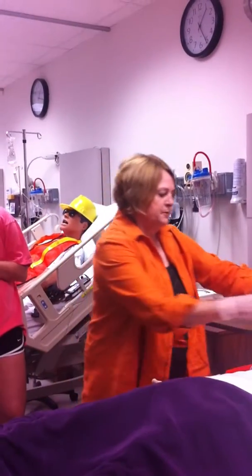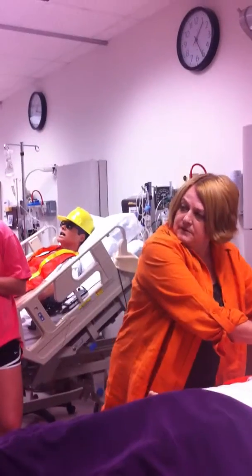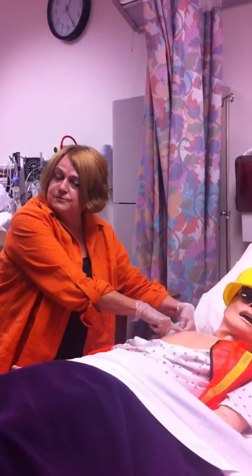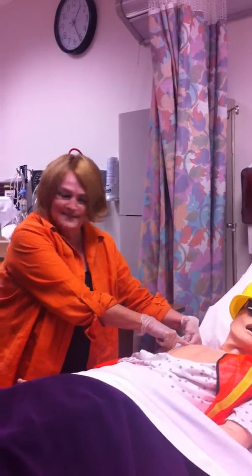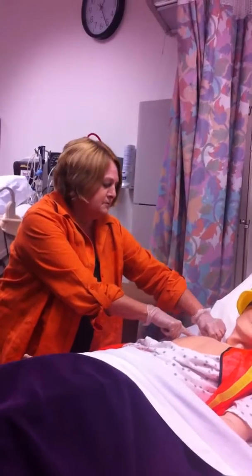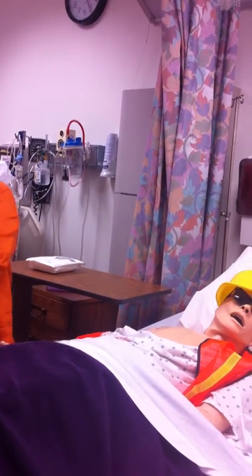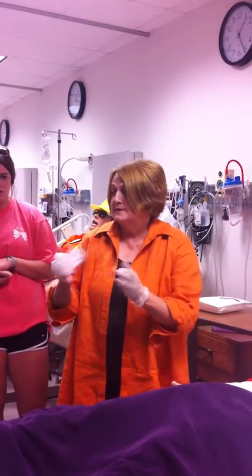As I pulled that dressing off, I would make sure that I kept the little blue hub kind of under my control because we don't want to accidentally discontinue a central line. Okay? So, pretend. I hate using the word pretend in lab. I think you should always have what you need. But pretend. Here's my dressing. Take my glove off. And you don't need a mask. You do not at this point.